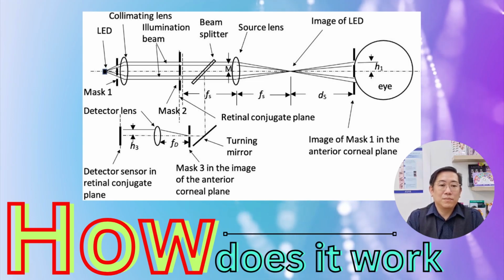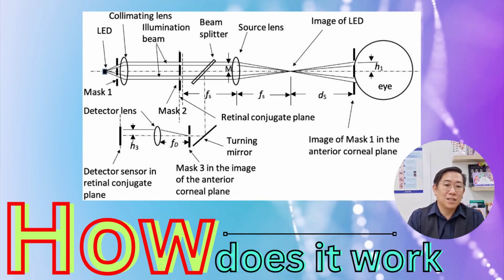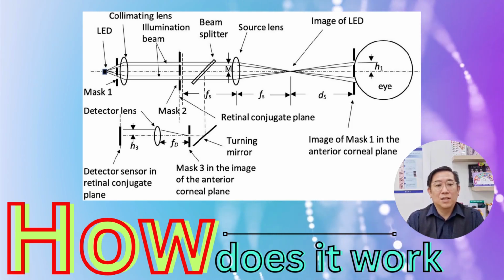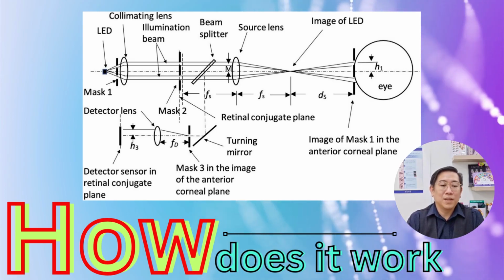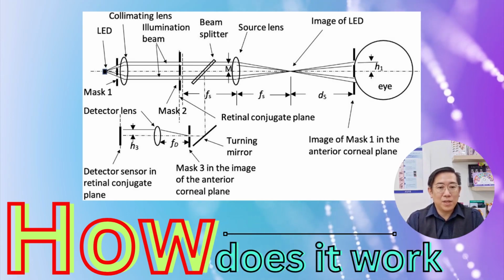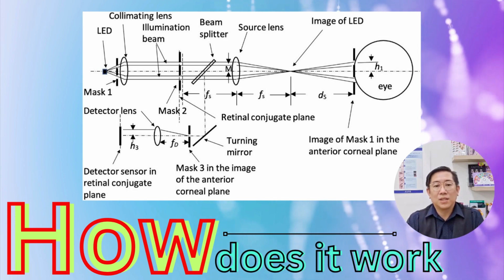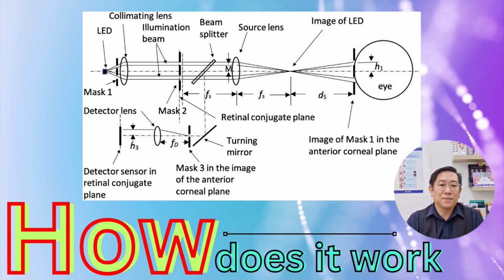For the final output, the device then displays objective results such as spherical and cylindrical error, axis of astigmatism, corneal curvature if it's integrated with keratometry, and axial length or IOP in some models. This data helps the optometrist proceed to the subjective refraction or further evaluation.